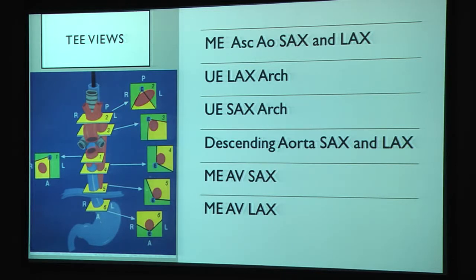So you're still going to assess function of the left ventricle, seeing if there's any issues with that. You're going to try to assess the coronaries. You're going to look for pericardial effusions, pleural effusions as well. So these aren't the only images you want. These are just typical aortic images that you want to evaluate to ensure you're really evaluating this dissection, but then there's other images that you need to make sure that you're evaluating to have a clear picture of what's going on in this patient.